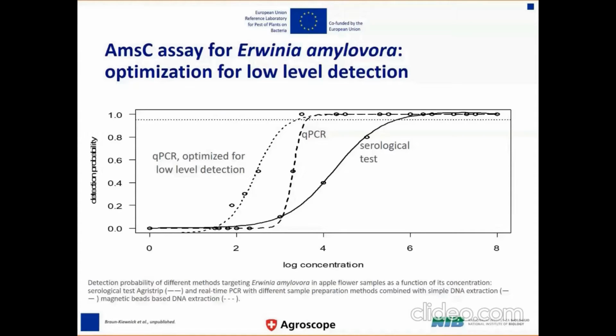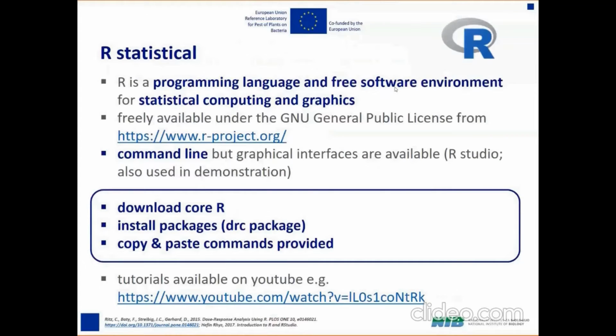So you can see that it basically provides also a bit more visual information on the comparative performance of tests than just tables. So this nonlinear modeling, of course, we can draw this sort of lines through the points, but that isn't really helpful, or at least is not that accurate.